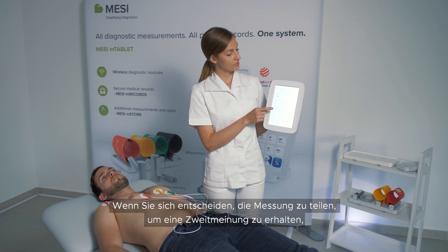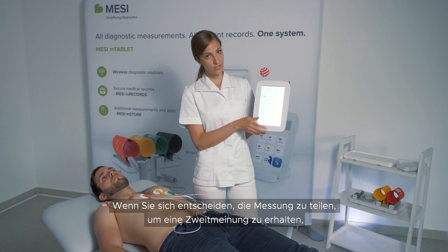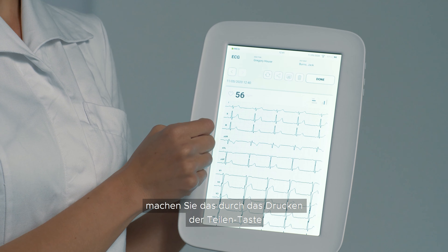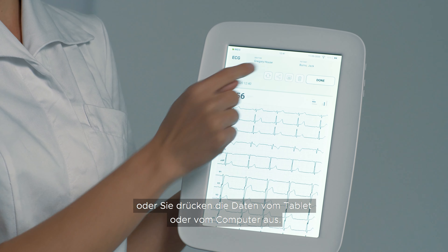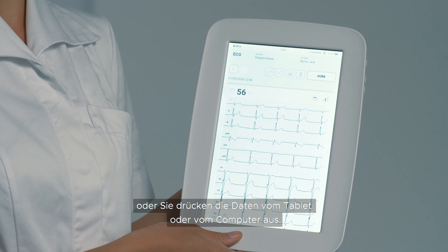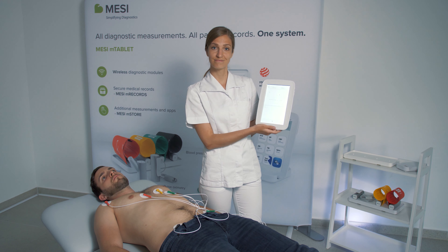If you decide you want to share the measurement for a second opinion, you can do so immediately by pressing the share button. Or you can print it out from the tablet or from the computer. And you're done.